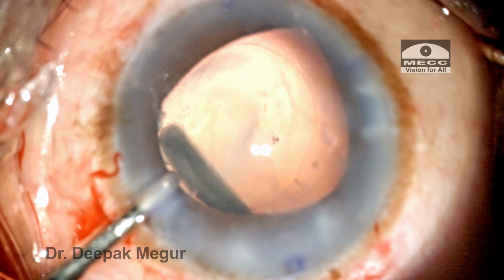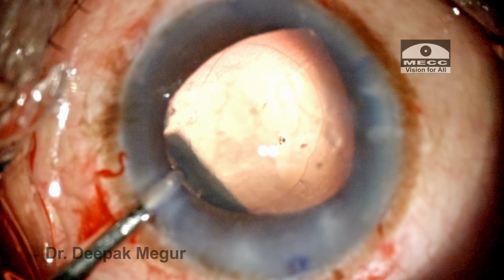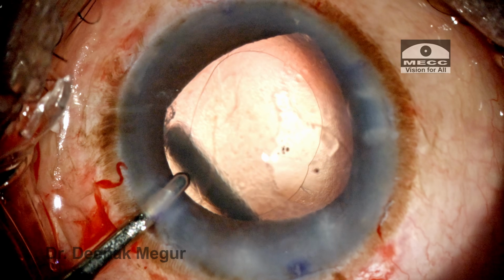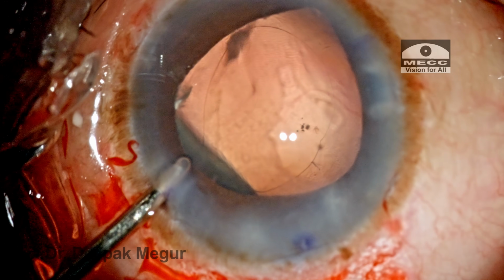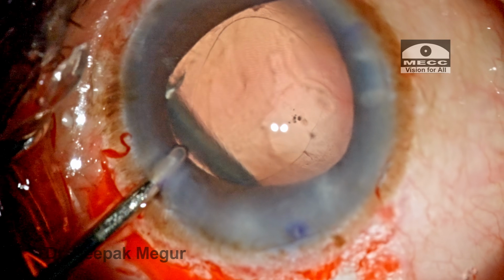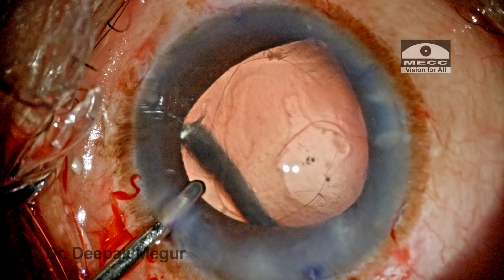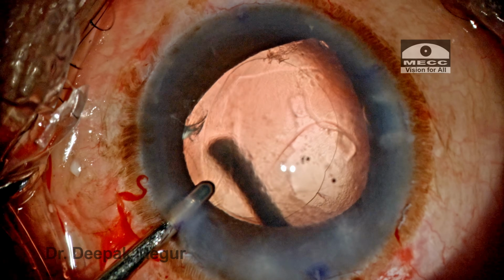The cutter is always held steady at one place as the cutting is going on. Just observe that there is no irrational moving of the cutter. It just stays at one place. So as cataract surgeons, we might be inclined to move the cutter left, right and center, but being still is the most important principle to be followed. Just be there until the entire zone in that particular region is taken care of. Once that zone is finished, you can always move the cutter to the adjacent area.